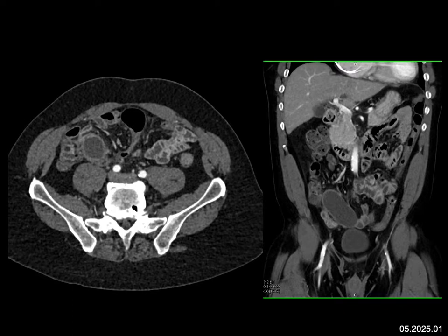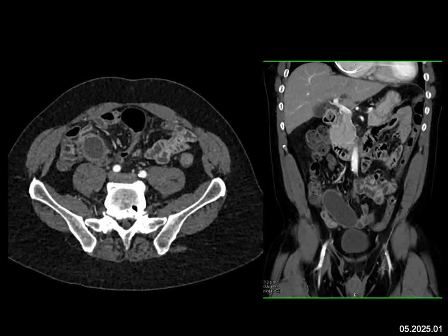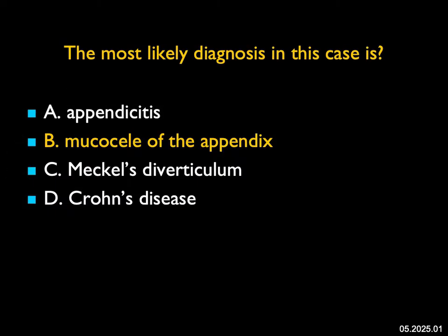You could think about a Meckel's, but the location coming off the cecum here is best for an appendix. It's not Crohn's disease where there's wall thickening or areas of strictures or prominent vasa recta. When you see a markedly dilated appendix, you've got to be thinking of appendix pathology, and you've got to think about a mucocele of the appendix — a very, very classic diagnosis. Patients sometimes have this incidentally, while other patients present with severe right lower quadrant pain simulating appendicitis, and sometimes they occur together.